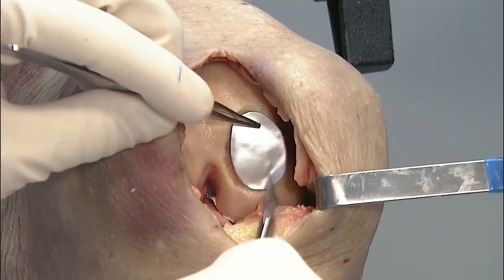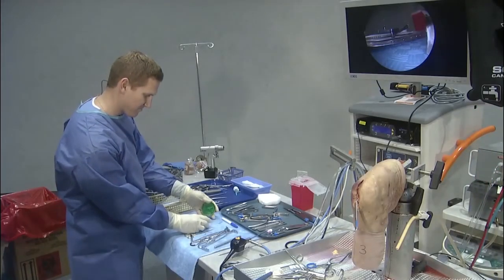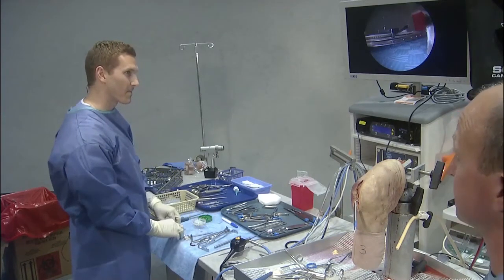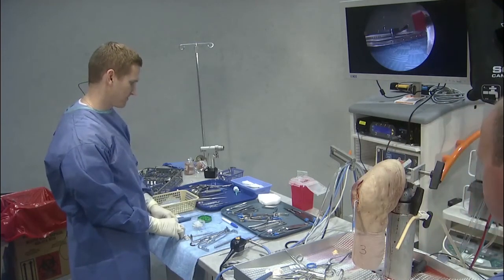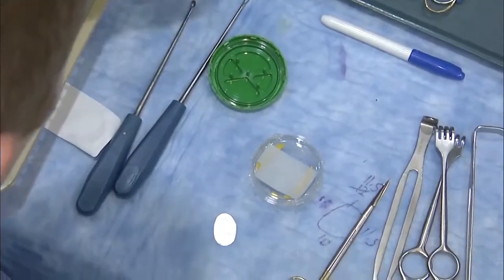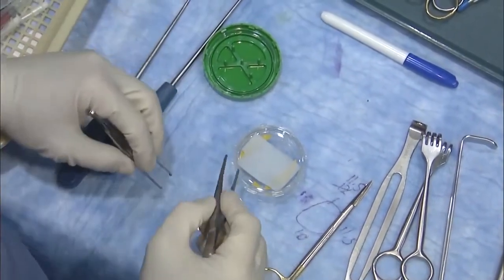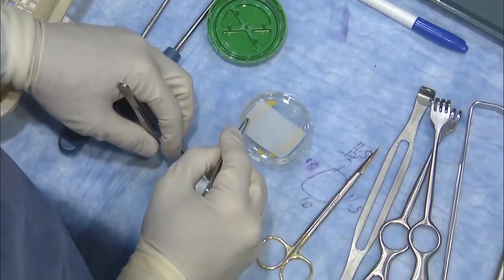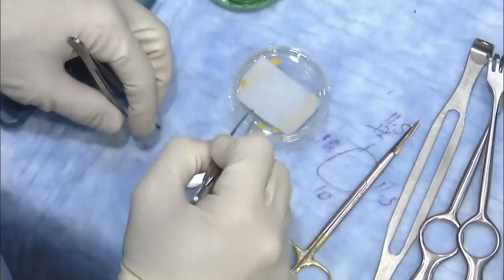I don't know if you can appreciate that. I don't know if you can have an exterior camera here. That would obviously be non-sterile. This is just for the demo, but that would be handed to him, and then he would have to lift it out, essentially. So what I would do is have two non-tooth forceps typically in my cartilage specials pan, and the recommendation is when you have this notch in the lower left corner, the rough side up is the cellular side.